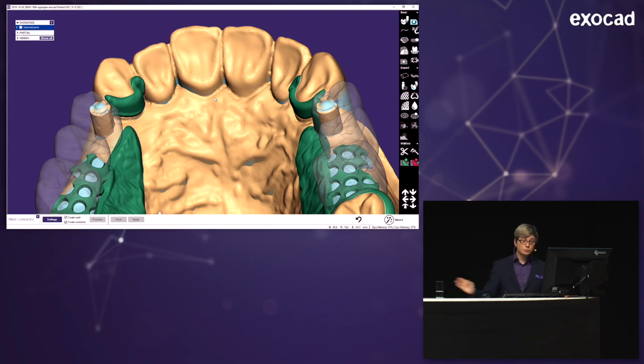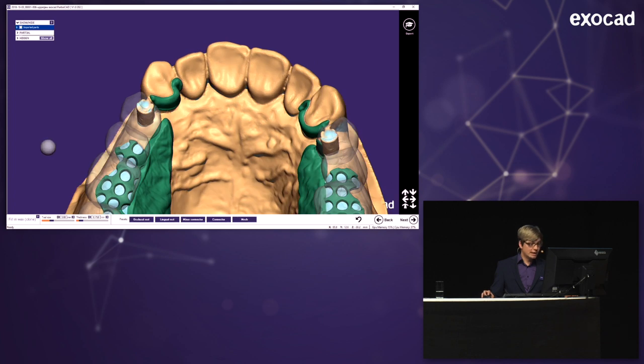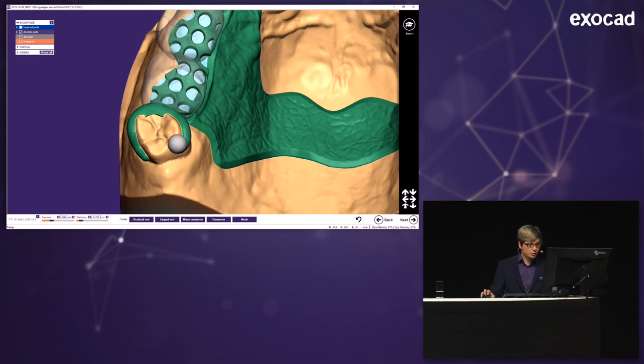And now I'm switching back to the wizard, which now is down here in the right-hand corner. You see, switching to the expert mode just opens up all the different tools at once. So it's a little bit confusing. So the wizard helps you get just through a normal design. So the fill-in wax clone actually is a bit like the freeform tool, a little bit. You actually just add wax to your model, to your refractory.